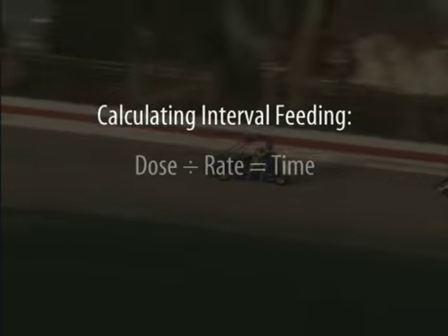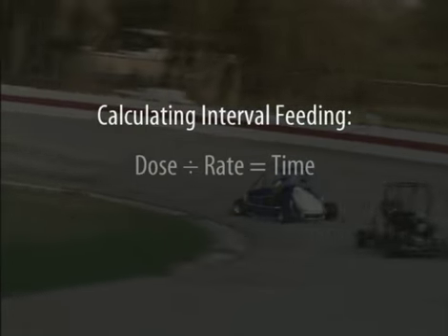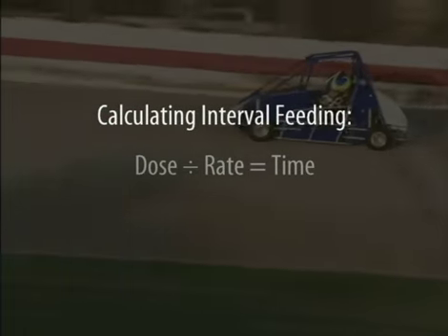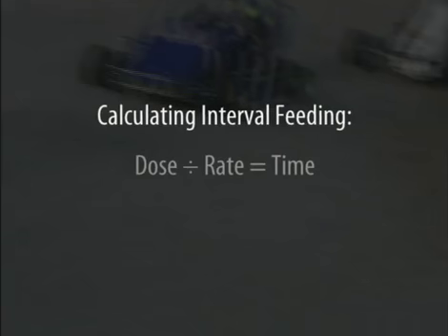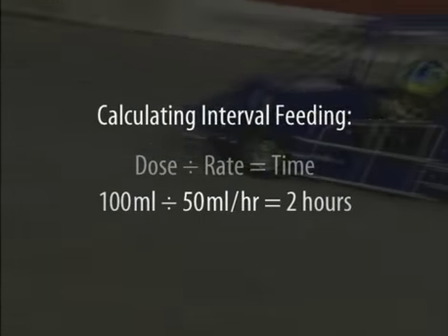The first step in calculating how to program an interval feeding is to divide the dose by the rate to determine how long it will take to deliver the first feeding. In this example, 100 milliliters divided by 50 milliliters per hour equals 2 hours.